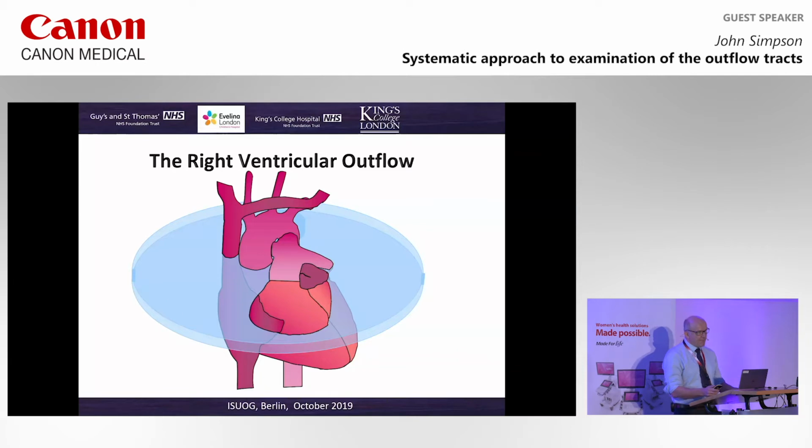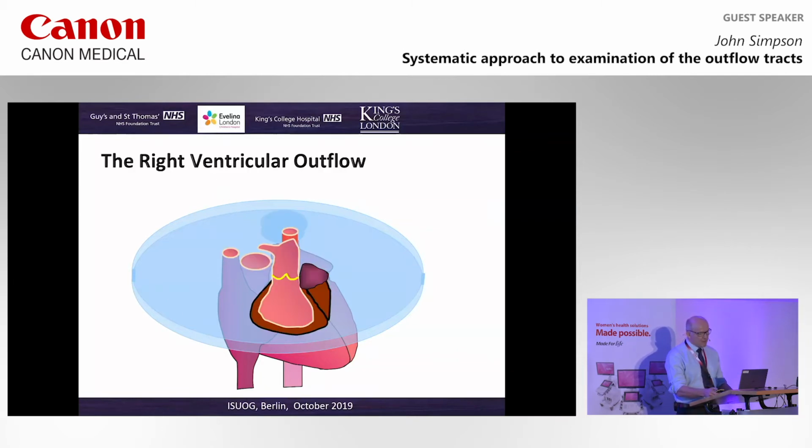On sweeping further up, this is the cut which you're obtaining into the right ventricular outflow tract, which essentially goes antero-posterior and divides early. And you will usually see the right pulmonary artery and the continuity into the duct. Sometimes seeing the left pulmonary artery is a little bit more difficult.